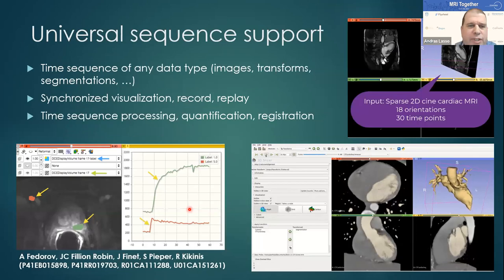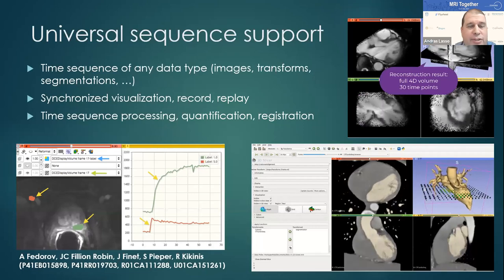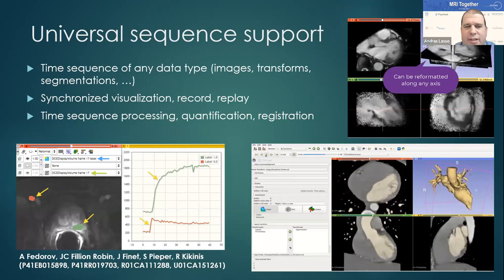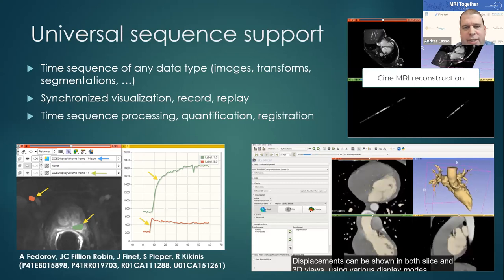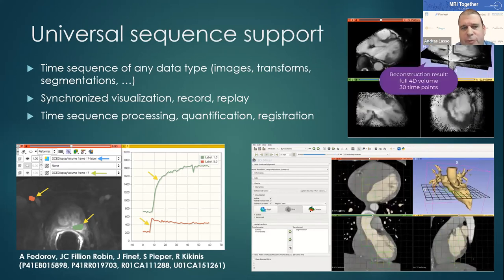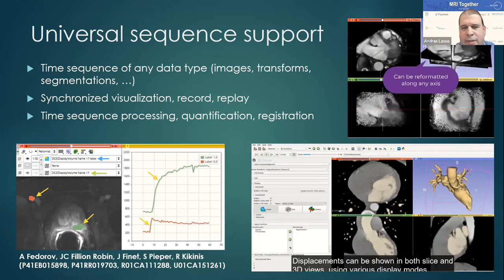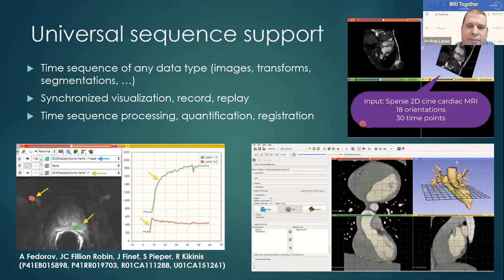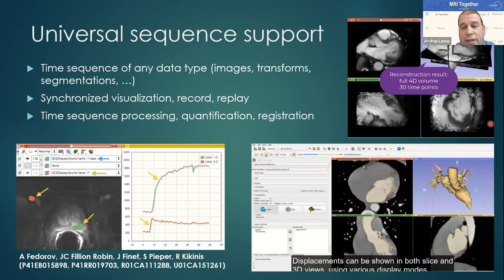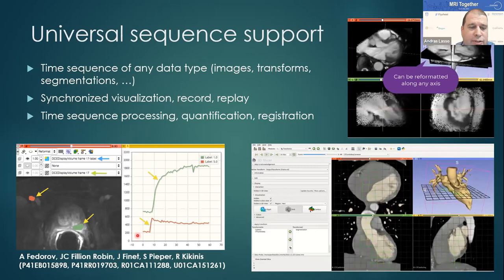A feature not everyone may be aware of is Slicer's universal sequence support, which means that sequences of any data type — not just images, but transforms, segmentations, models, or anything — can be managed as a time sequence. You can record, edit, replay, and process them. For example, a sparse rotation or cine MRI sequence can be reconstructed into a dense volume, or you can compute intensity statistics on a 3D volume sequence.